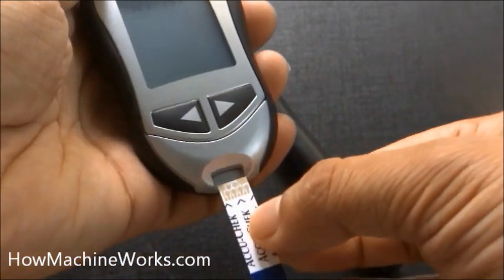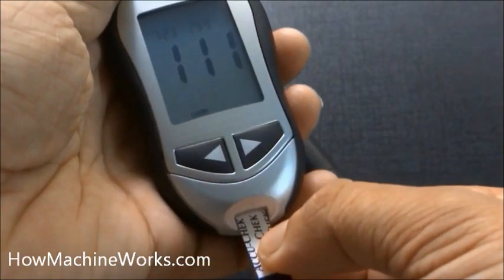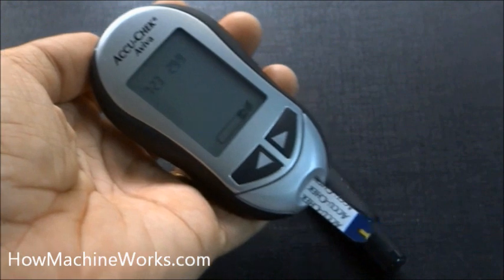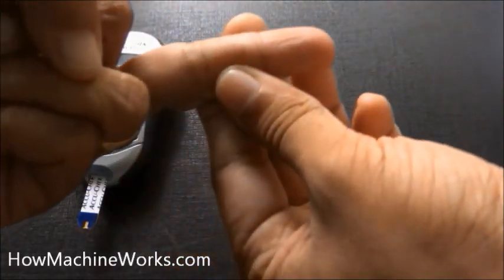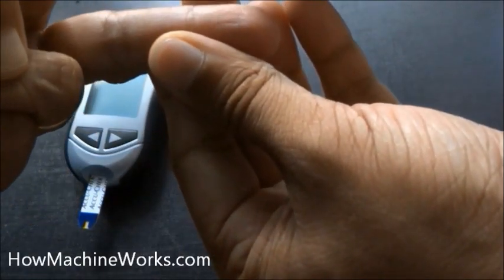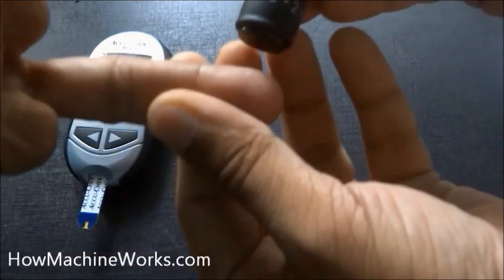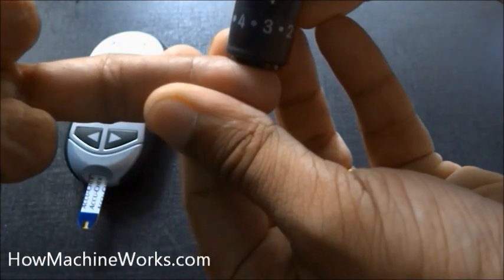Now slowly insert the strip and give it a beep. The symbol changes and it asks for blood. Now it's asking for blood to be dipped in. Take the finger pricker — the depth is aligned at two. It was tried but not enough, so advance it to three for more depth. Then press the release button.